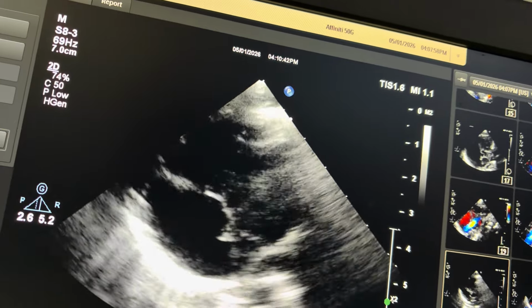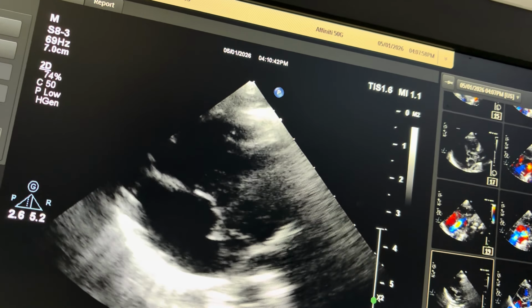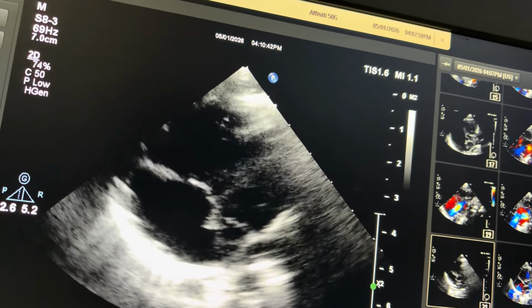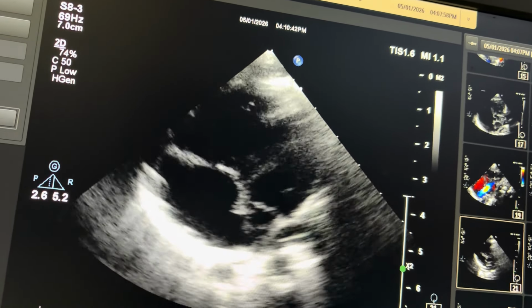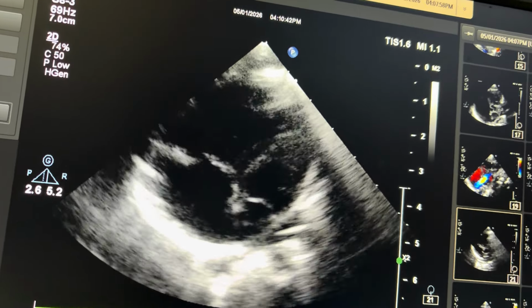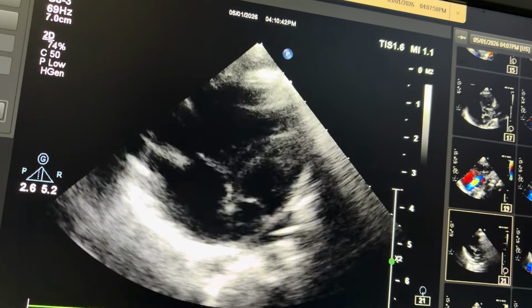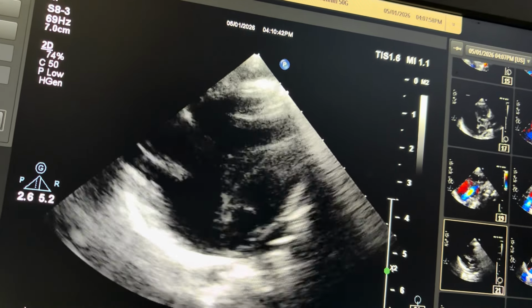So whenever you get a very dilated right atrium, and the oxygen saturation of that child is very low, not maintained, you will get this kind of scenario. I am not showing all the parts of this patient's video, only this much. This case has a vein from the common venous confluence, one vein going from this chamber, that is called a vertical vein, going upward and joining the left innominate vein.